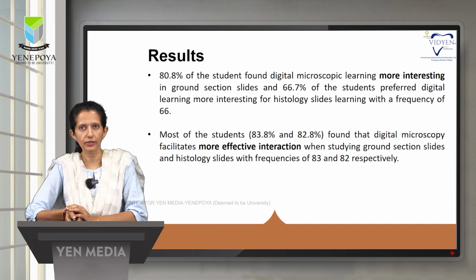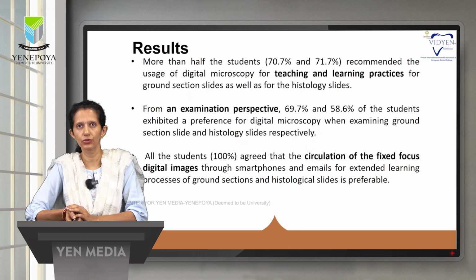Most of the students found that digital microscopy facilitates more effective interaction when studying the ground section slides and histology slides, with frequencies of 83 and 82 respectively. More than half of the students recommend the usage of digital microscopy for teaching and learning practices for ground section slides as well as the histology slides. From an examination perspective, 69.7% and 58.6% of the students exhibited a preference for digital microscopy when examining the ground section slides and histology slides respectively.